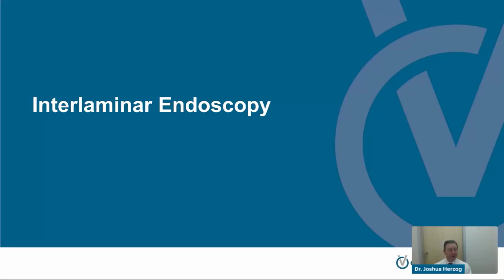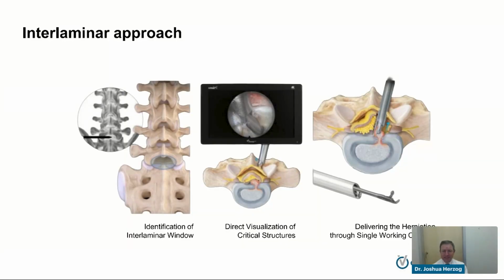And we've shrunk that down even further now to the 7mm cannula or endoscopy device to do some of the similar work that we were doing with a more open procedure, into an interlaminar endoscopy. So I'm going to show you some pictures of what that looks like. This is that window I'm talking about on the left side. That blue circle there is the interlaminar window, and that's where we would normally access the disc herniation at the L5-S1 level, even with an open procedure or a tubular.